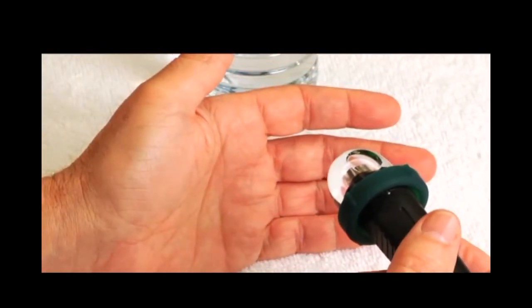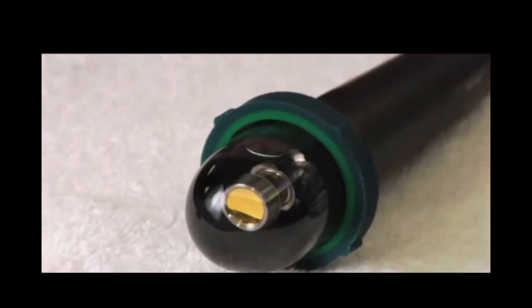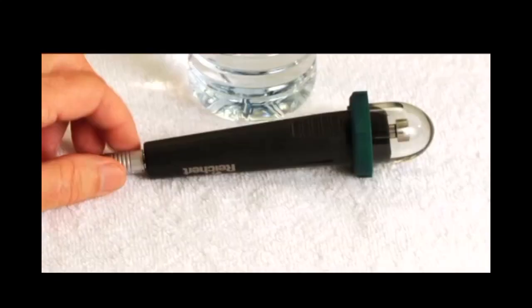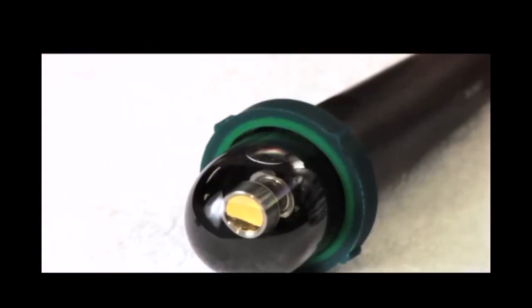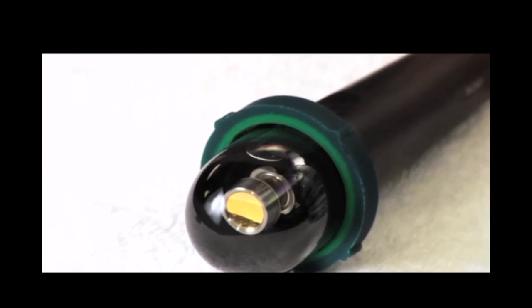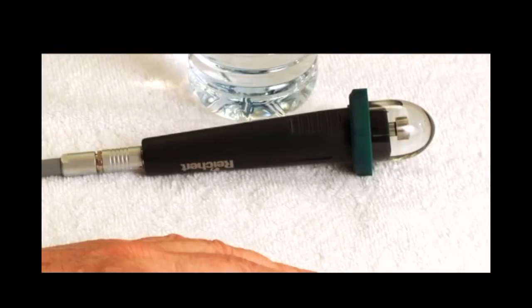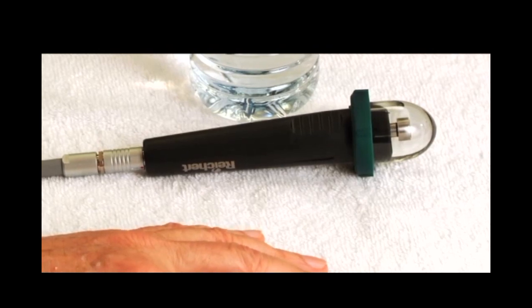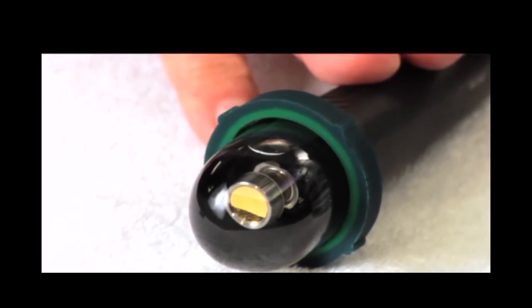Also, this is sterile for single use. There's a study that's being submitted to the literature, and that manuscript deals with the issue of sterility. 34 people were tested, had UBM on both eyes, looked at 4 quadrants each eye, and then subsequent to the examination, the bag surface itself was swabbed, taken to the path lab, and what was found was that 80% of all the samples taken grew out microorganisms that were associated with either endophthalmitis or keratitis. So this is a single-use device.